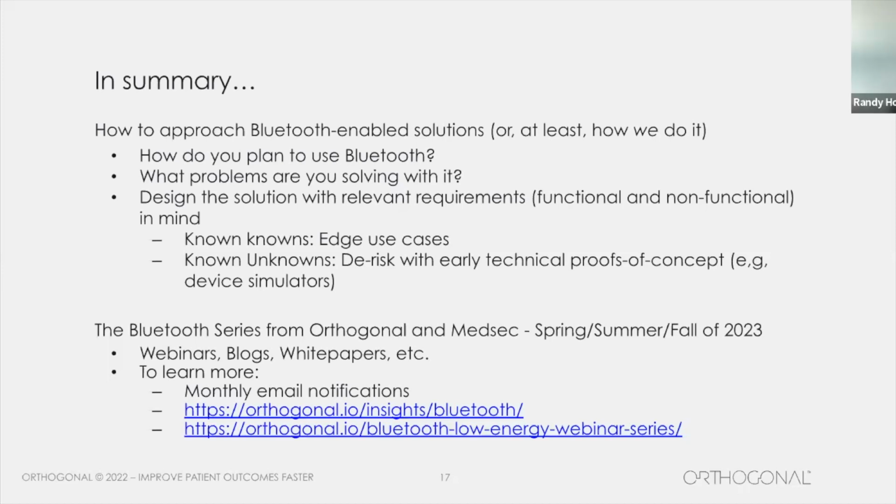Okay, so in summary, quickly, how do you approach developing Bluetooth-enabled device solutions, or at least how do we do it at Orthogonal? And I'm sure that Buddy can speak to that at MedSec. Really what it comes down to is, how do you plan to use the Bluetooth, right? What are your intended uses? What are the use cases? Who's using it in what situations? What problems are you using Bluetooth to solve?